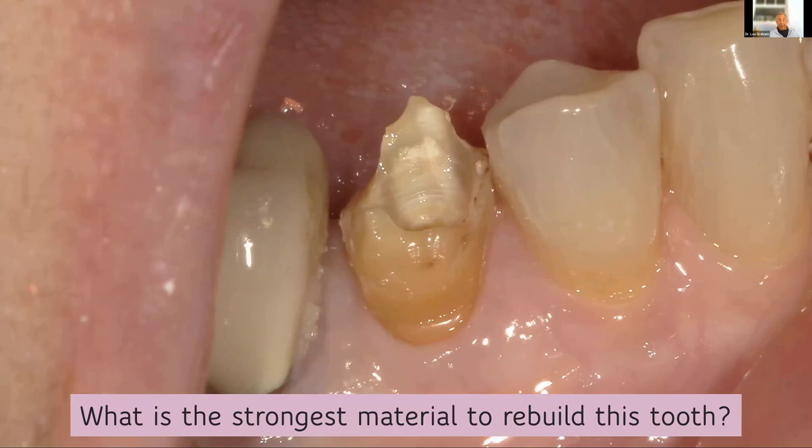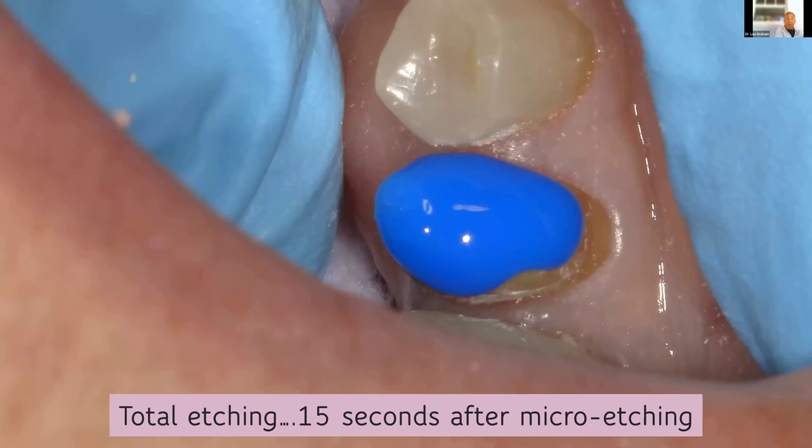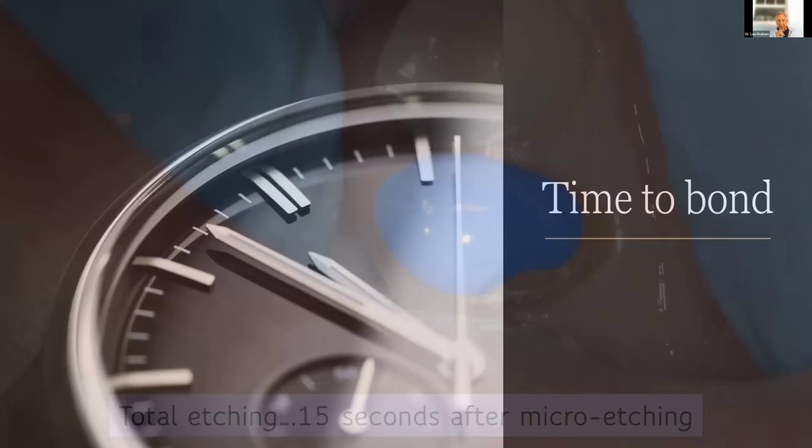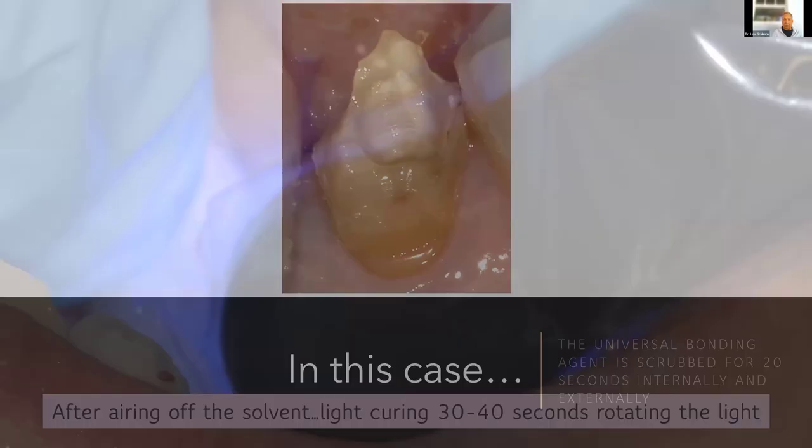I'm going to do a total etch. And I want to be clear — I have micro-etched to remove the entire debris. Micro-etching will absolutely increase your bond strengths. Studies show the particle size below 40 becomes irrelevant, so whether you're using a 27, 29, or 40, I'm not concerned. Now I'll start my bonding — etched, rinsed, bonding agent placed. With my bonding agent, I am going to scrub internally and externally, bonding the entire thing. Air dry for 10 seconds at a distance, then go closer, and now you're going to light cure.